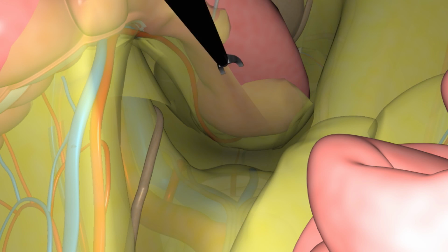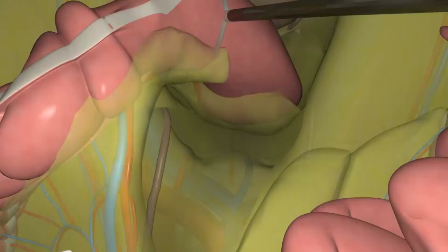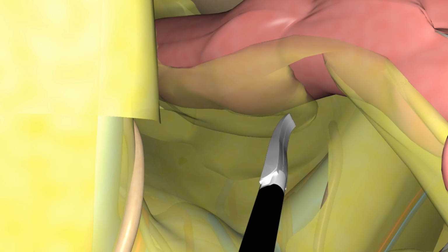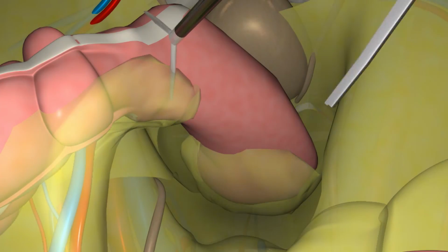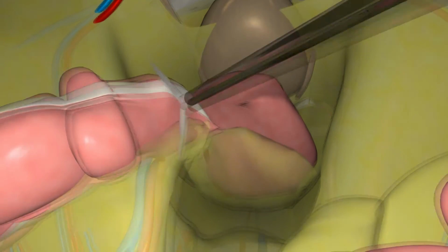Once the upper rectum is freed, the area of distal mesorectal transection is chosen, allowing a distal margin of at least 7 to 8 cm away from the lower edge of the cancer. The fat surrounding this area is cleared. Doing so, the superior hemorrhoidal arteries are divided in the posterior upper rectum. The distal division is performed using a linear stapler.